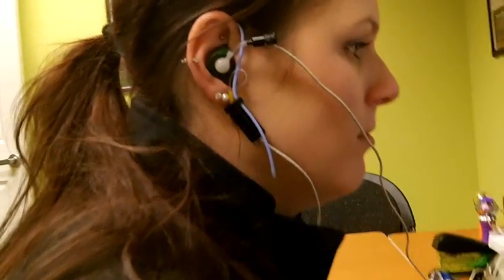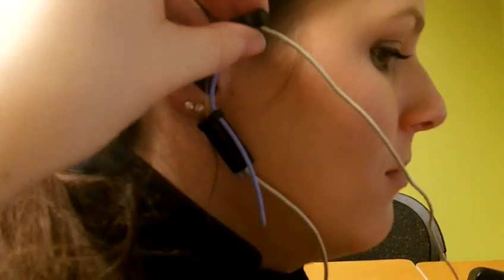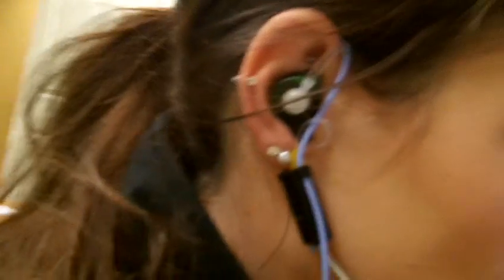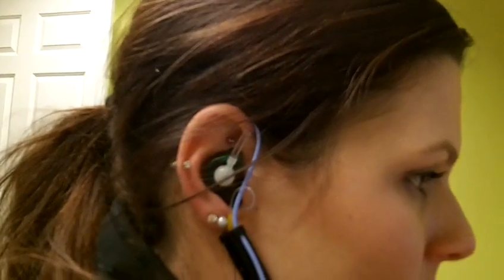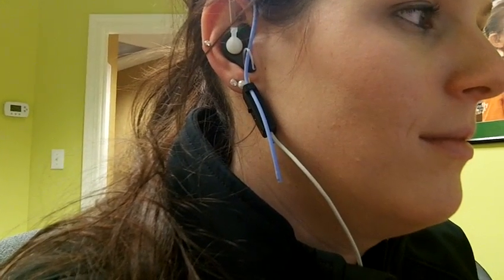So now what you're going to do is take this RECD transducer and take it out of the tubing. So you're left with that. And in its place, you're going to put the hearing aid that you are testing. We've already got it plugged into the Phonak software so that we can adjust it as we go.